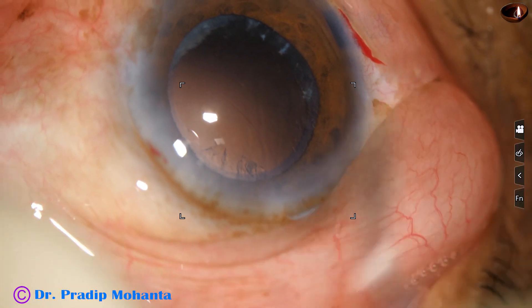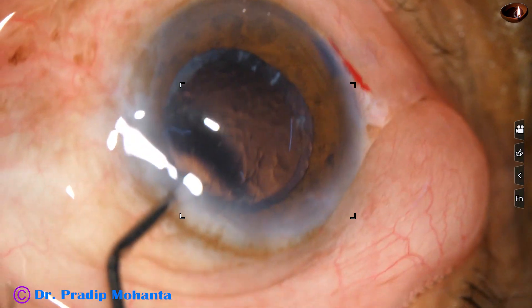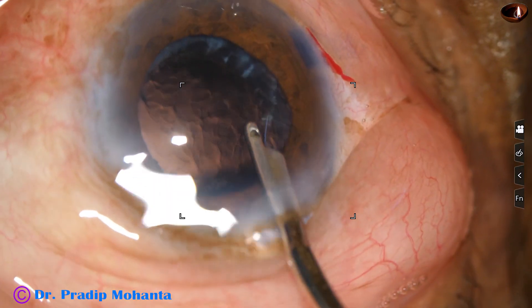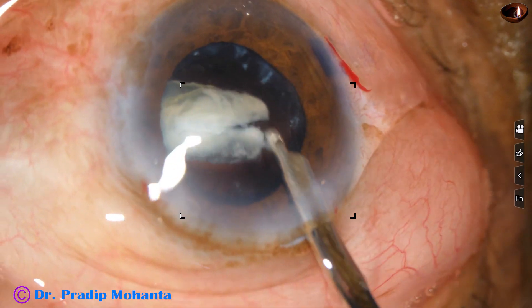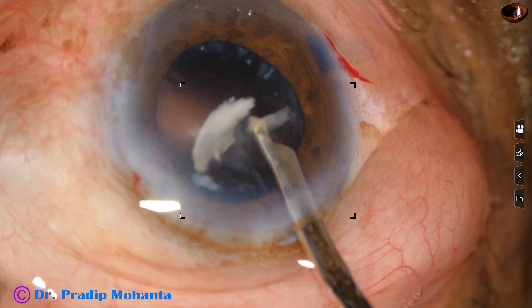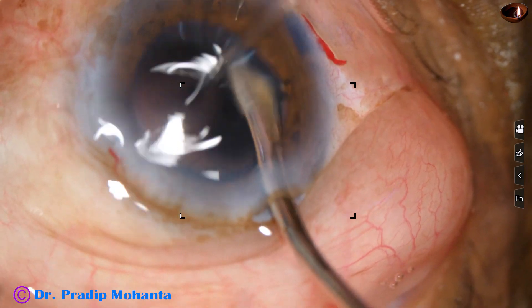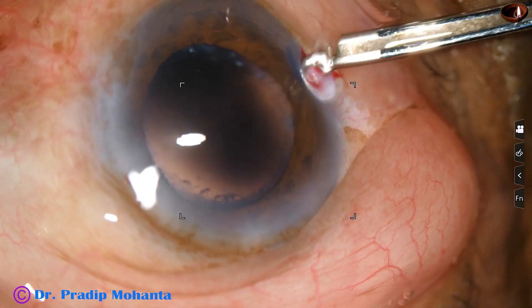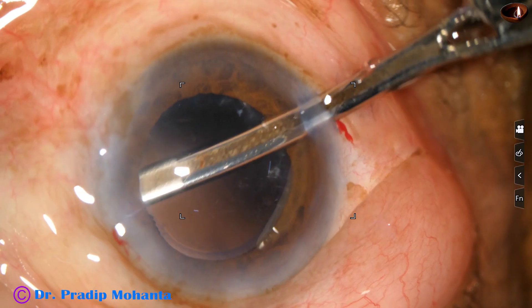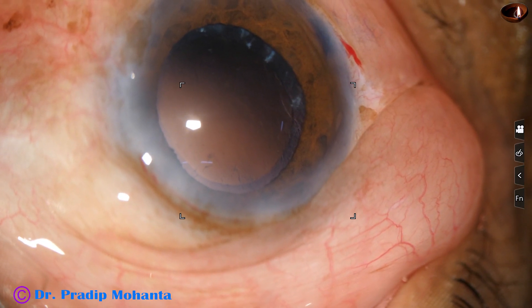And now it is time to remove the cortex. I usually inject a bit of visco so that as I start aspirating the cortex, maintenance of the chamber is easy. See this white cortex. I remove the cortex from the upper part going through the 8 o'clock side port, and it is done.